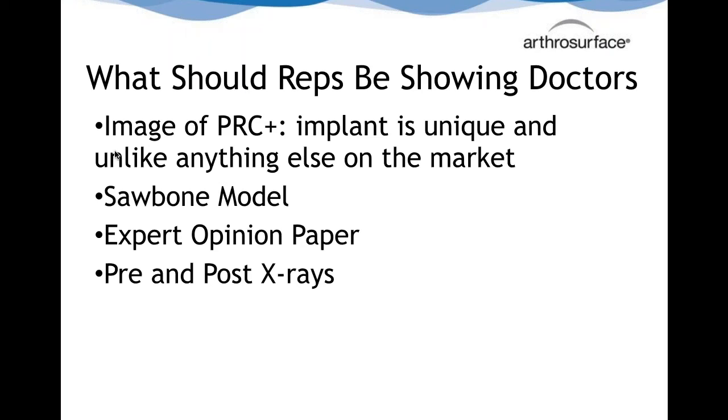Having this in there will create a congruent contact with the lunate fossa that I think in the long run may end up doing better than the proximal carpectomy. I think only time will show this. And have them do some sawbones.